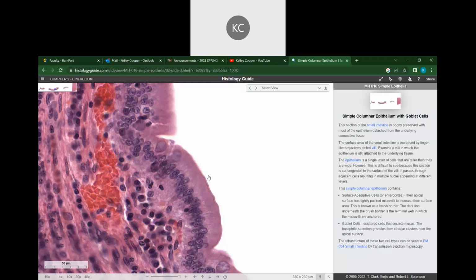So if this is associated with the GI tract, one of the main functions of our GI tract, along with breaking things down, is to absorb things, right? We need to absorb it and get it into the blood, whether it's sodium or water or glucose or amino acids, whatever it may be. We have things that are able to break down those products, and then with the assistance of the microvilli, we're able to absorb those things into our gut, right?